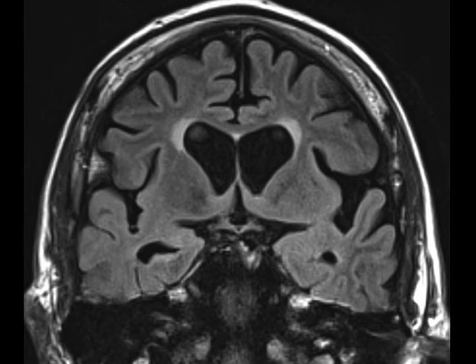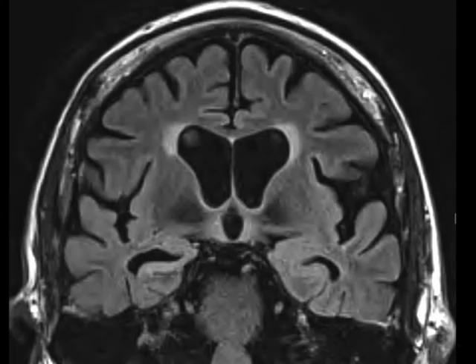On these dedicated coronal plane images, we see that the right hippocampus demonstrates marked volume loss and distortion of the normal morphology, as well as slightly asymmetrically increased signal on the T2 and FLAIR sequence images. There is corresponding dilatation of the temporal horn of the right lateral ventricle. The contralateral hippocampus appears within normal limits.